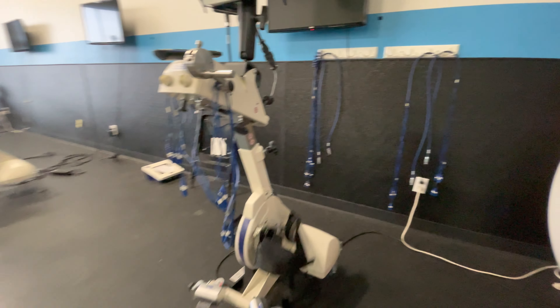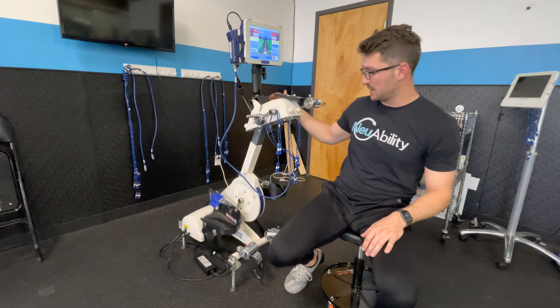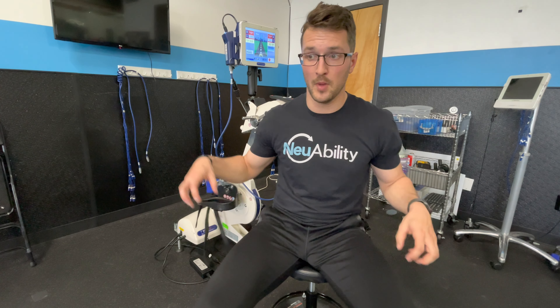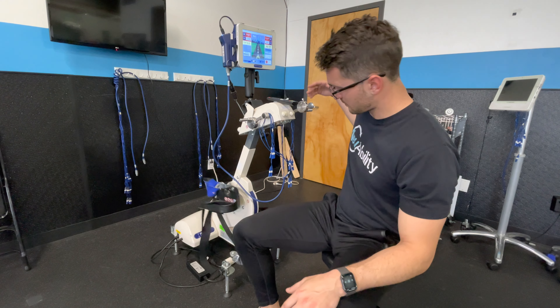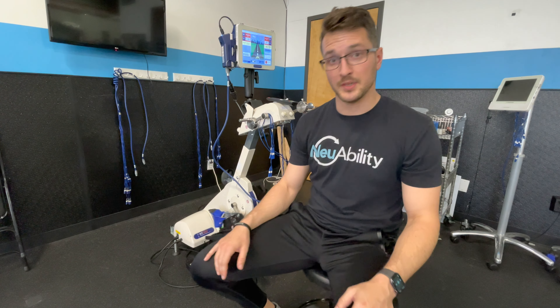So this is our FES bike — it allows for contractions of paralyzed muscles with customization based on muscle fiber size. For example, the quadriceps is a very large muscle group requiring a lot of stimulation, versus the calf or tibialis anterior which needs less. We can also customize the height, footrests, and leg guides, in addition to the stimulation levels.